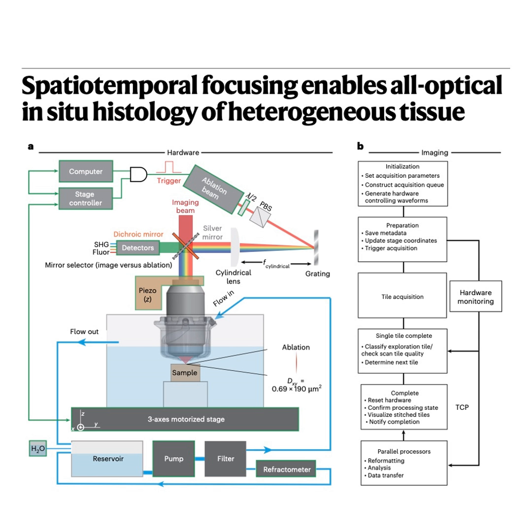Exactly. And to handle that heterogeneity we talked about, it's smart. It actually uses different imaging modes depending on the type of material it's looking at. So it changes how it sees based on whether it's looking at bone or brain. Precisely. Specialized eyes for specialized materials. For instance, for the rigid stuff, like the collagen-rich bone, it uses backscattered second harmonic generation, SHG.